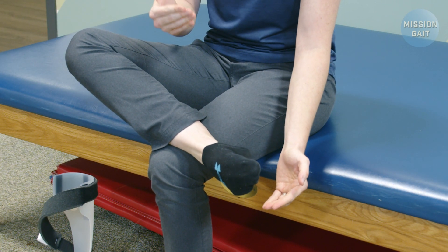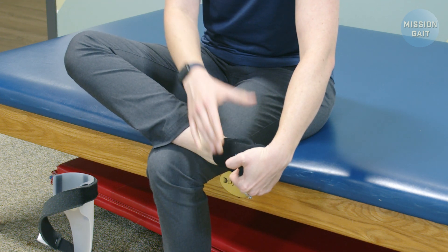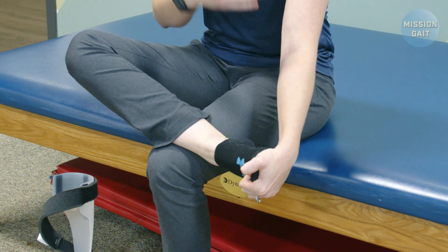You can also break up the tone some with stretching. Oftentimes when the foot is turned inwards, the toes are also curled a lot. So if you just gently stretch those into extension briefly before you put the AFO on, it'll usually go better.